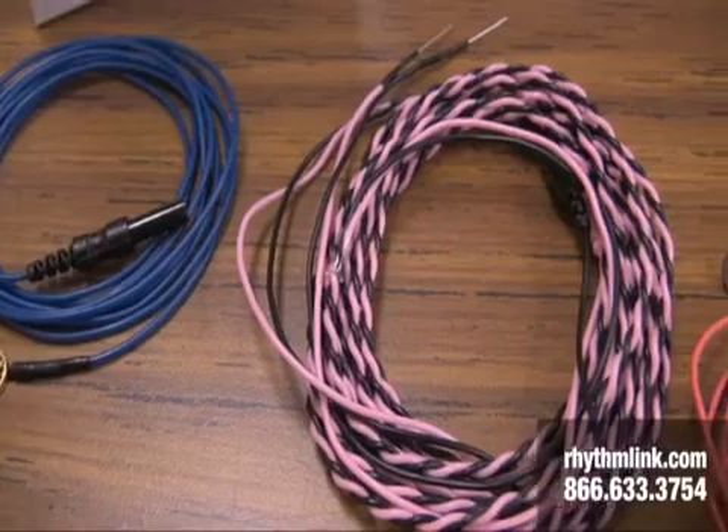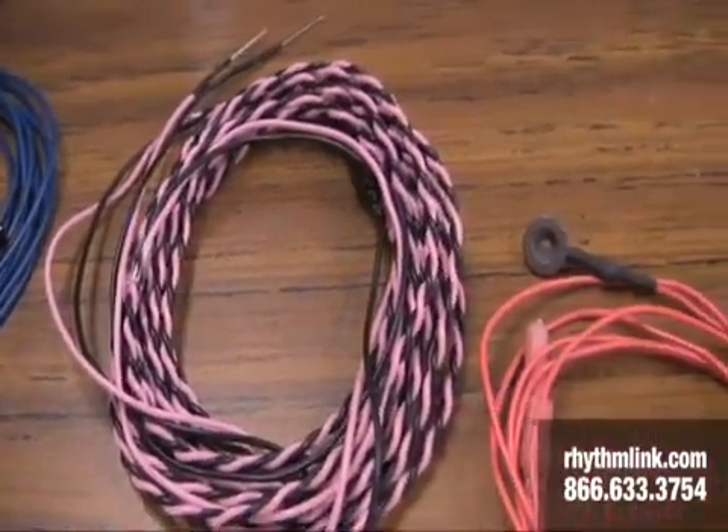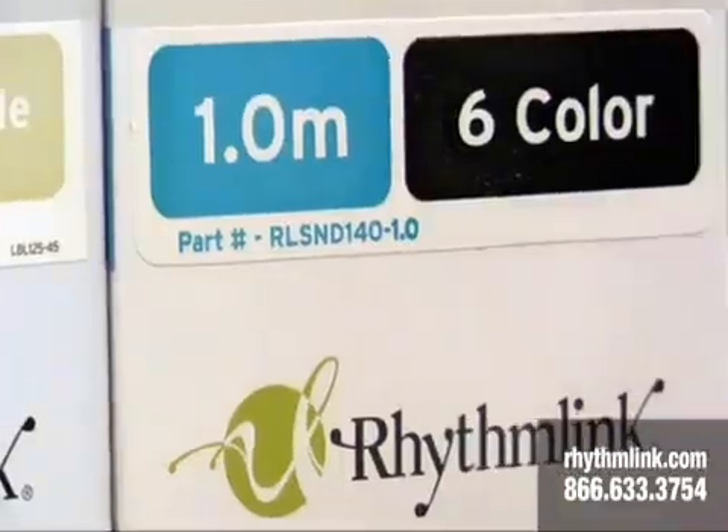Another advantage of the paired electrodes is the color coding combinations. For surgeries, especially complex surgeries, a clinician might put 20, 30, or even 40 or more electrodes on a patient. All those electrodes and lead wires can be confusing. So if you have a universal color coding system that your particular hospital or lab uses, having all those extra colors becomes very important. It's a safety feature and a convenience feature. RhythmLink has been at the forefront as far as offering different types of color combinations.